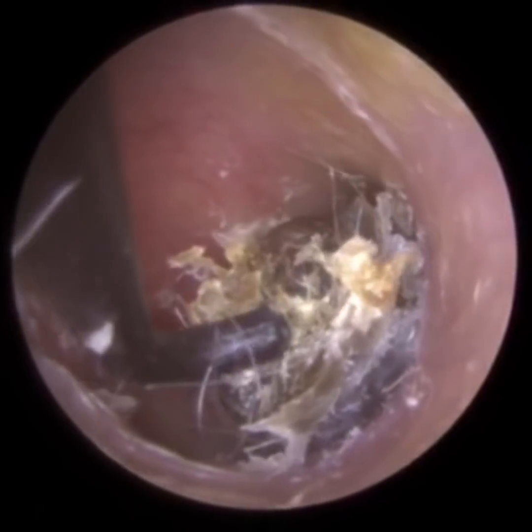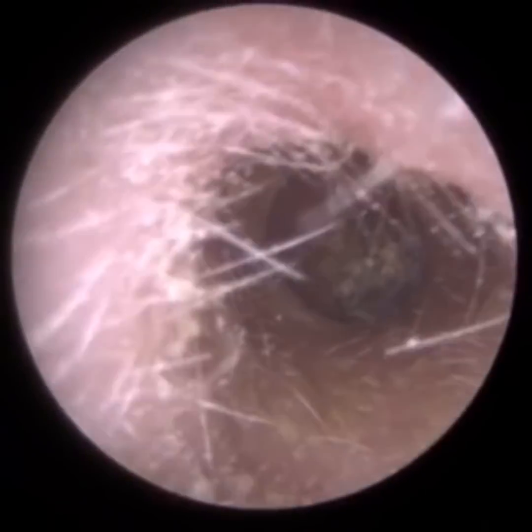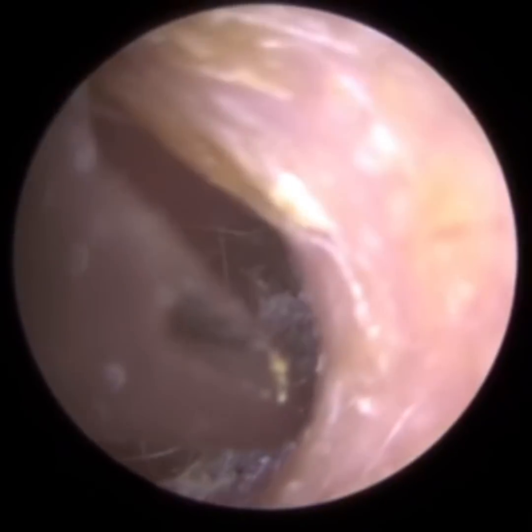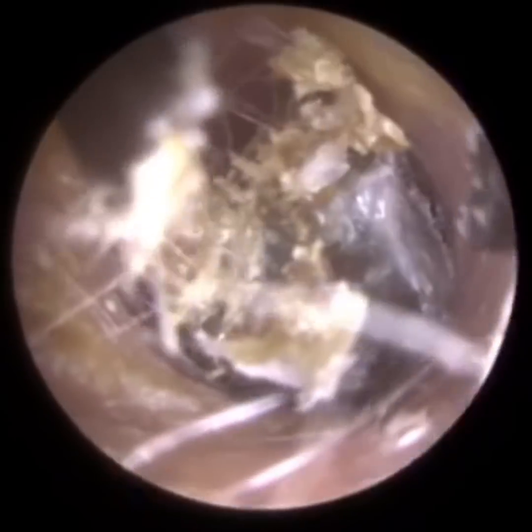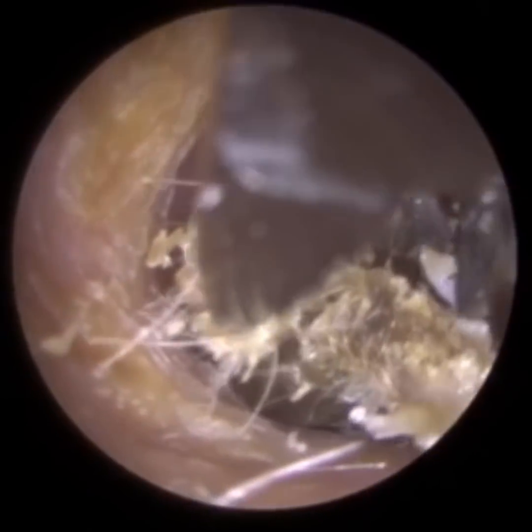There was the slightest of openings here, so I tried to get the hook behind the wax, but it was just too lodged. Fortunately, the forceps came to the rescue, though even then it was quite tricky. You can see the skin adhesions at the bottom adhering not only to the wax plug but also to the surface of the ear canal.